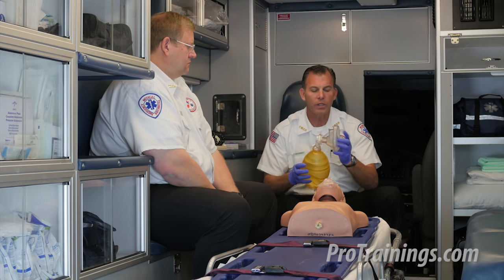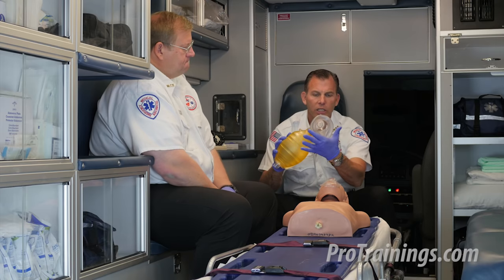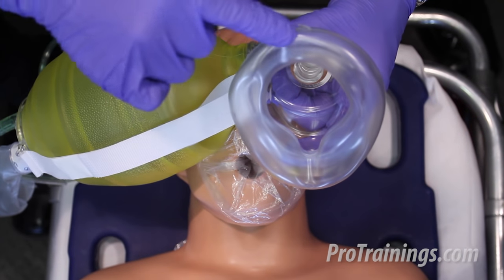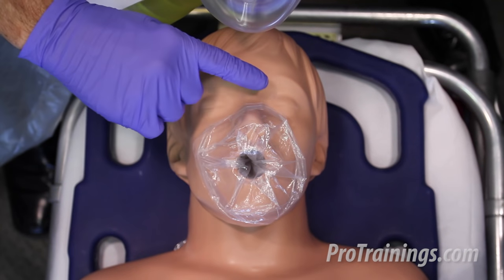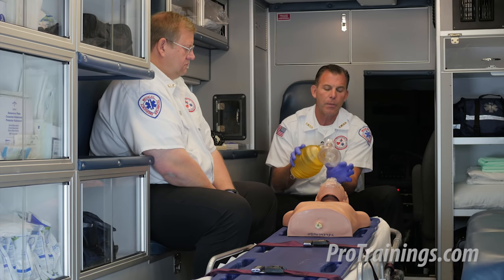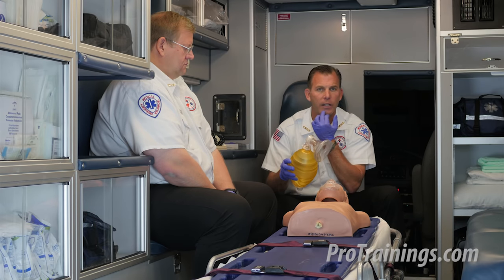When it comes to sealing the mask over the face of the patient, there are a couple of points to make. Look at the shape of this mask — you have an apex that goes over the nose of the patient, with a bell on the other end that's wider, and this should seal around the chin and face of the patient under their bottom lip. We're going to bring the apex part over the bridge of the nose while the bell portion fits over their mouth and seals around the bottom side of their chin.